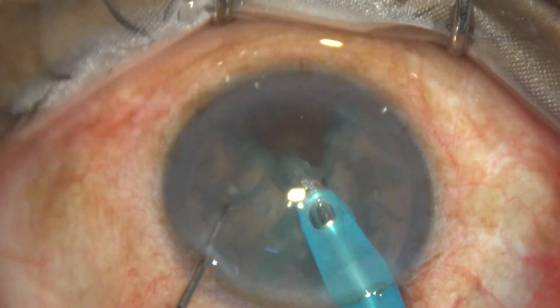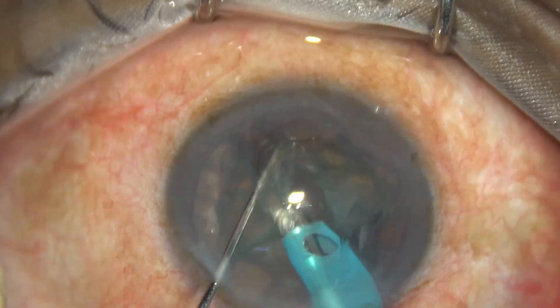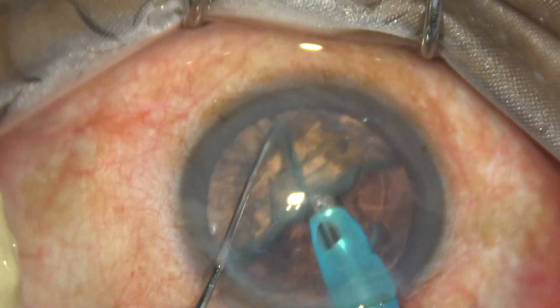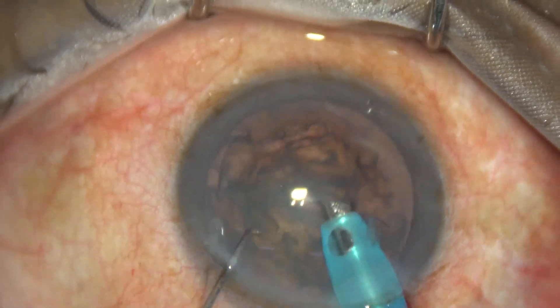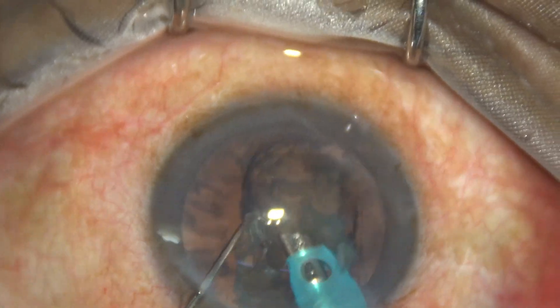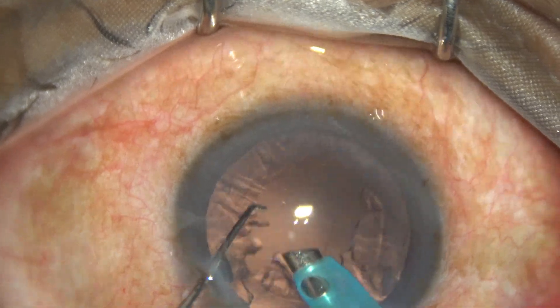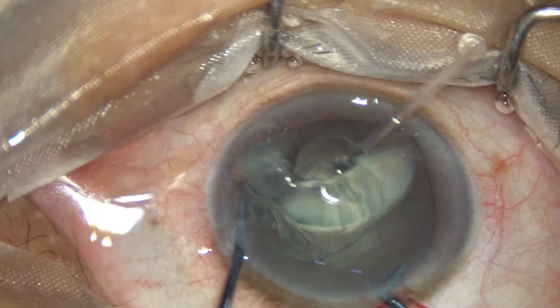Now each nuclear piece is emulsified. You just have to get a gap between the two pieces, hold one piece, bring it to the central part and emulsify. This is a soft cataract, but gradually we are going towards harder nucleus. This is grade one plus; this is a grade two or grade two plus nucleus sclerosis.